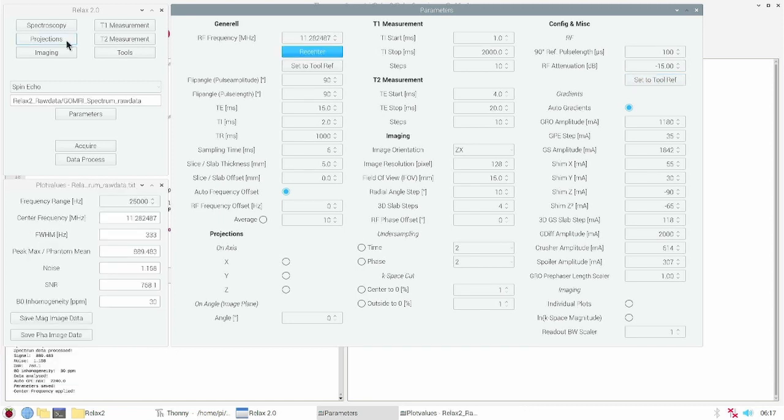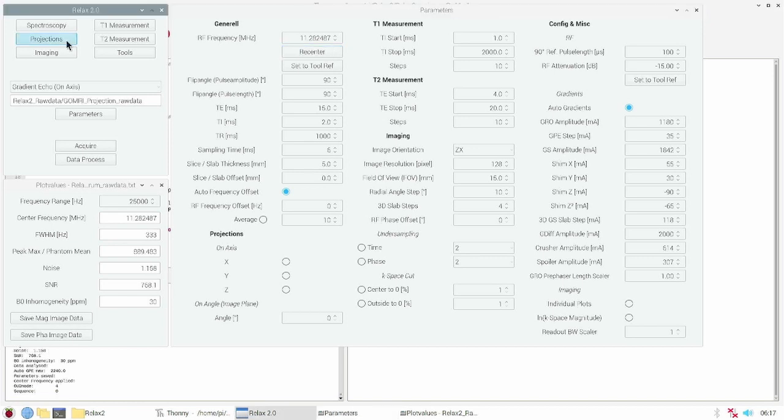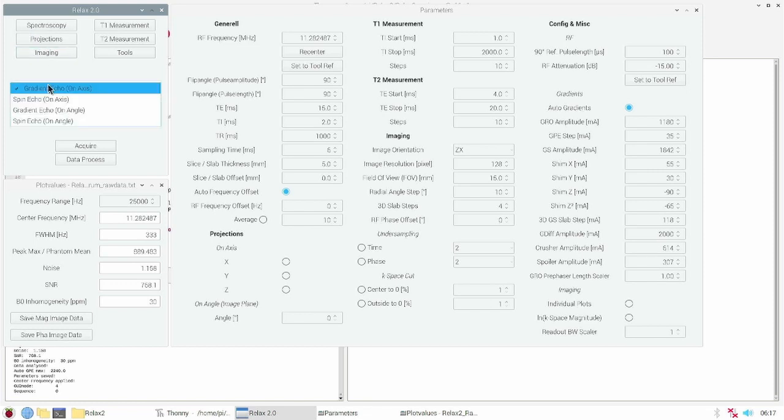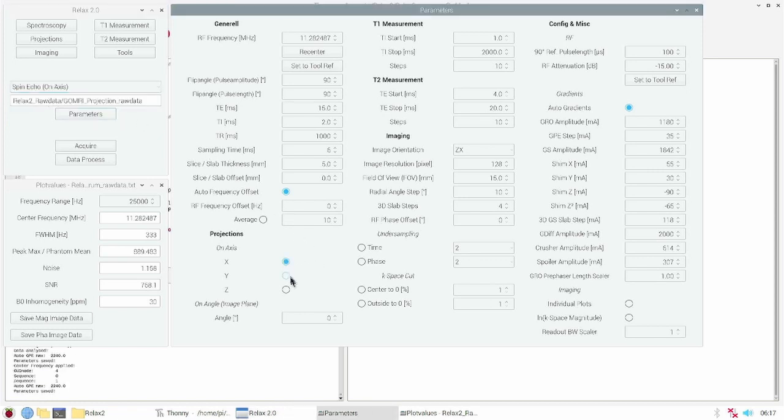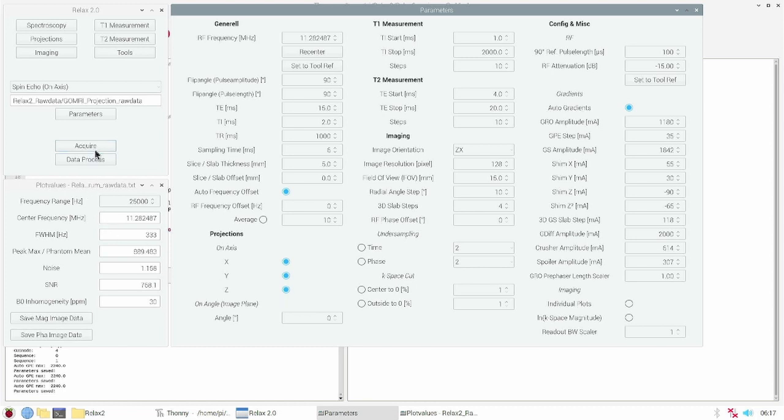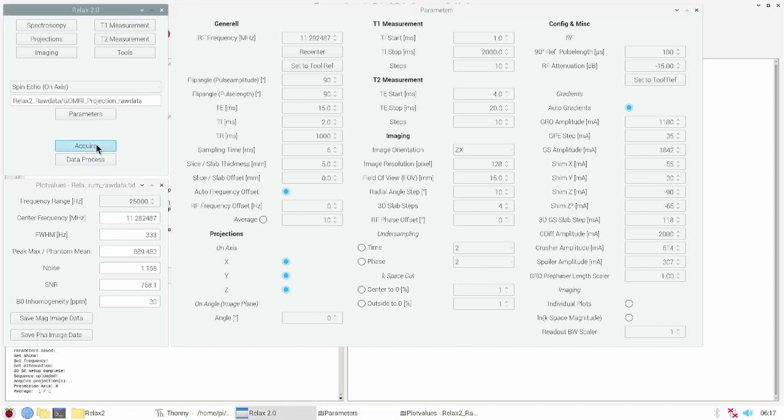After the setup we now can play around. First I want to introduce you to the projections. For that I choose the tab projections and choose the spin echo projection sequence on axis. I select the X, Y and Z axis in the parameter window and press acquire.